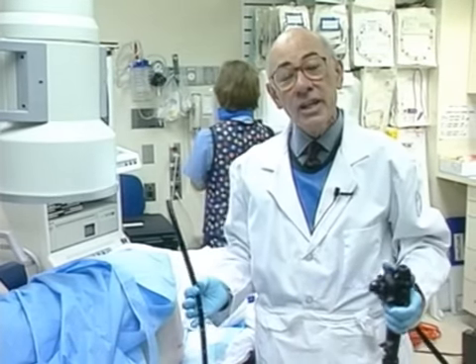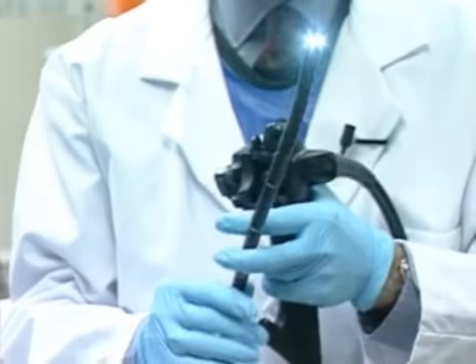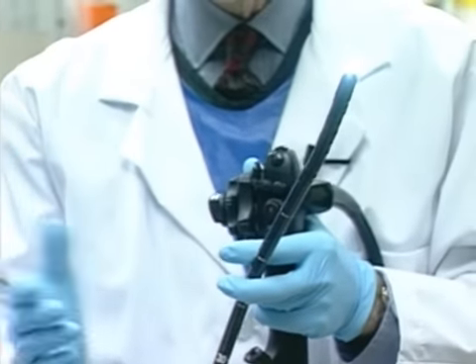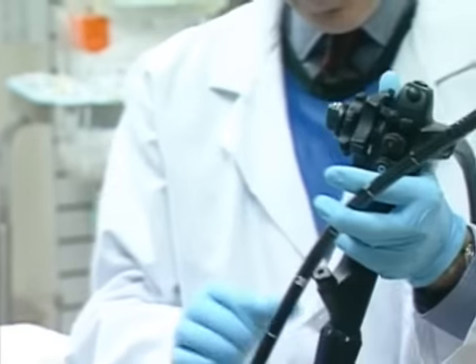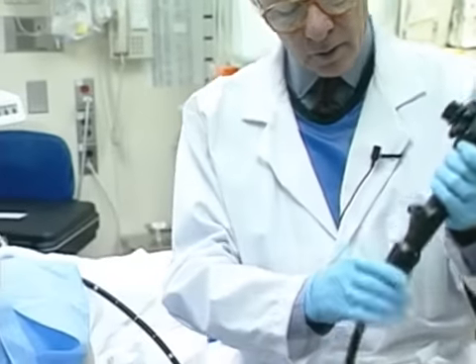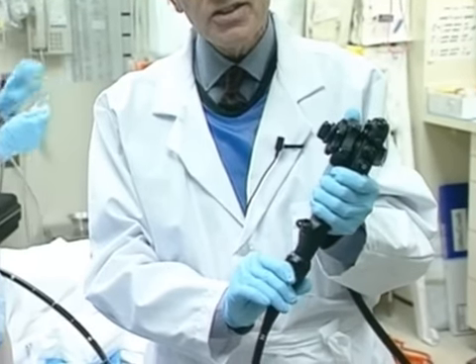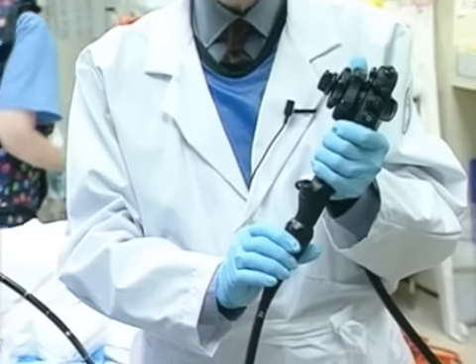This is a new and innovative flexible colonoscope called the InnerFlex scope. A PCF can be very floppy when one tries to do total colonoscopy with it, but this instrument has a very special gauge that will allow us to increase the stiffness of the instrument incrementally.